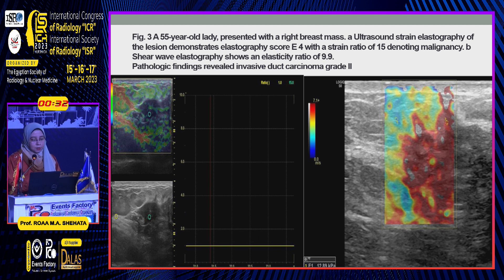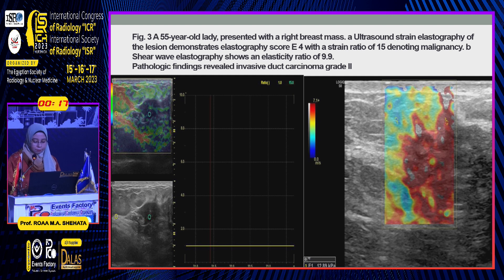This patient, 55 years old, presented with right breast mass. The lesion had elasticity score 4, mass strain ratio 15, and shear wave elasticity ratio 9.9, and pathology revealed invasive ductal carcinoma.